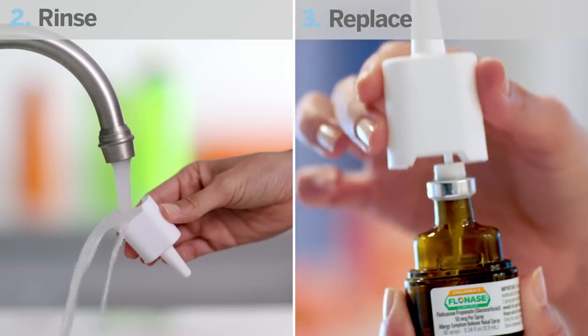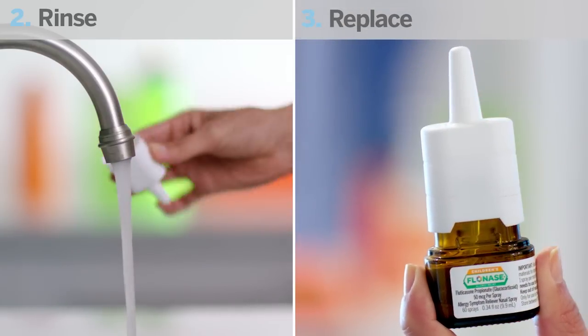If you find the spray nozzle is still clogged, simply soak it in warm water. Then repeat steps two and three: rinse, dry, and replace the nozzle and try again.